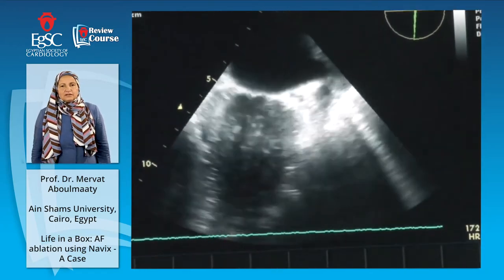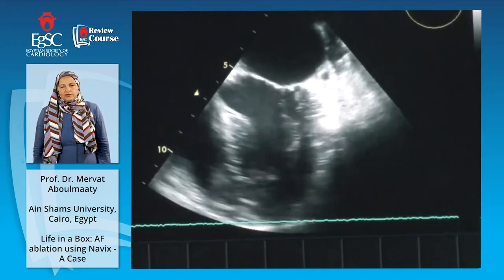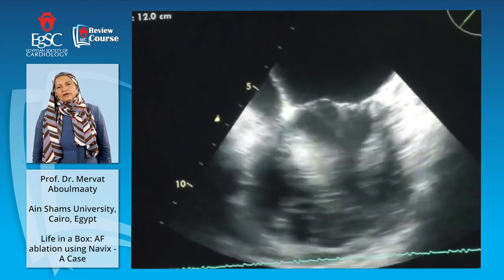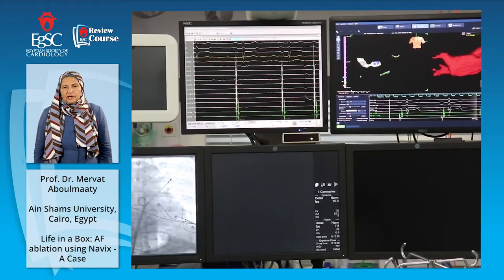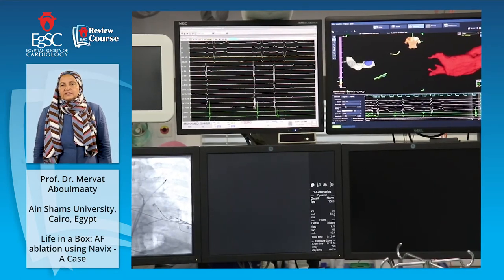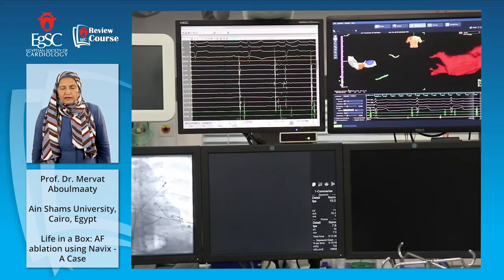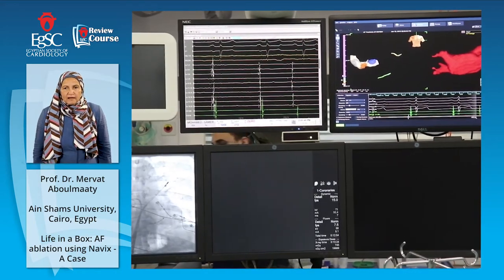Before we started, we also had the TE, making sure that the left atrium, before we started this procedure, this TE was done and showed a clear left atrial appendage. Sometimes we use it in the lab in order to help transeptal puncture for difficult cases. On the right side, this is the CT image, the red one, with the patient facing us, the appendage and the left superior pulmonary, left-sided veins and the right-sided veins. Here is the patient looking at us.